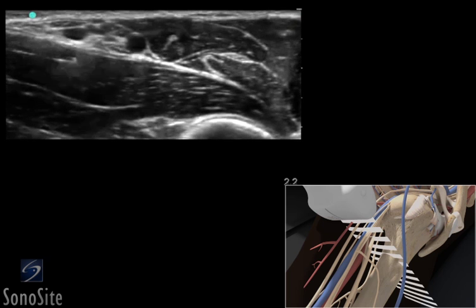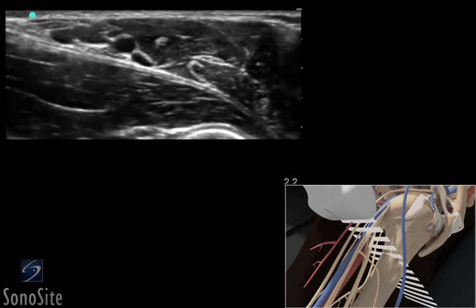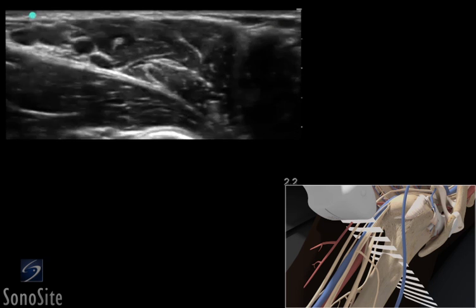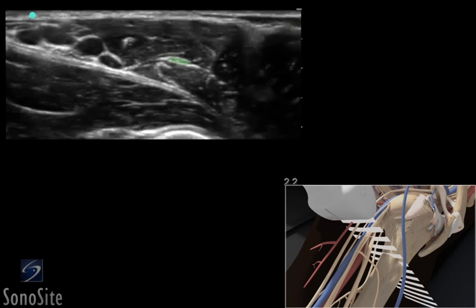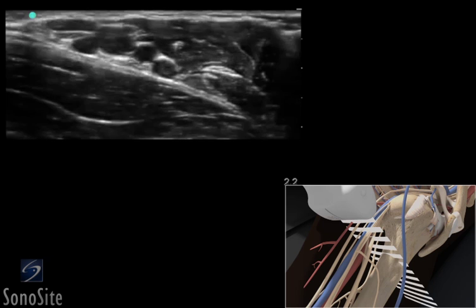The nerve positions will vary around the artery. The transducer is slowly moved laterally over the biceps and coracobrachialis muscles. The musculocutaneous nerve can be seen between these muscles as a small, bright, hyperechoic circle or triangle.